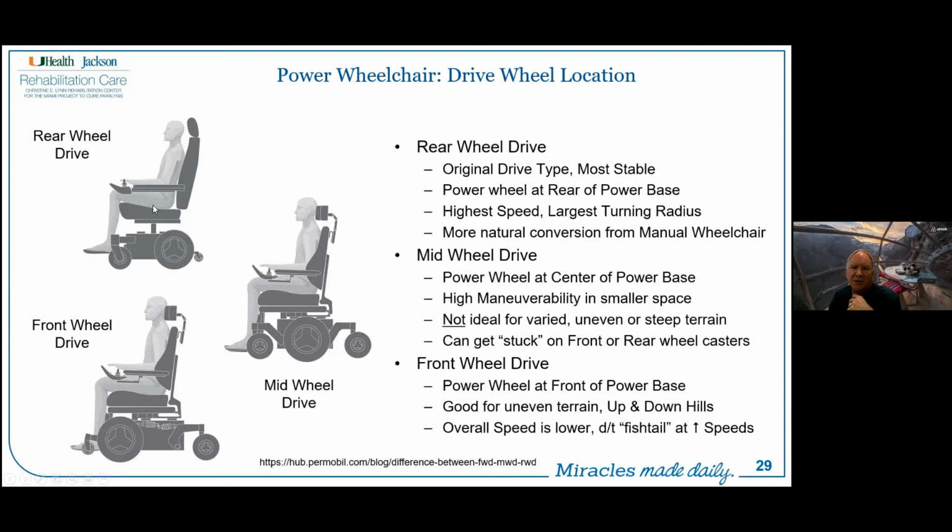These chairs are the ones with the highest speed, but they also have a large turning radius. They're not as mobile. And for persons who have been using a manual wheelchair, intuitively, it makes more sense to be able to drive these than the mid-wheel or the front-wheel drive.